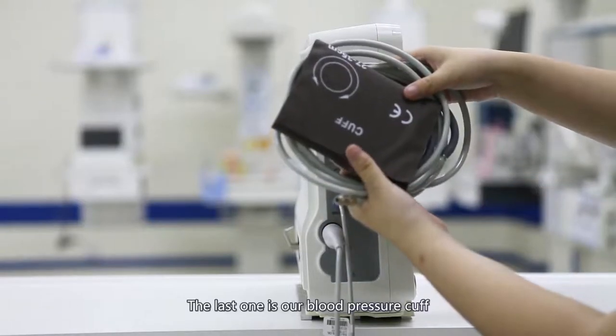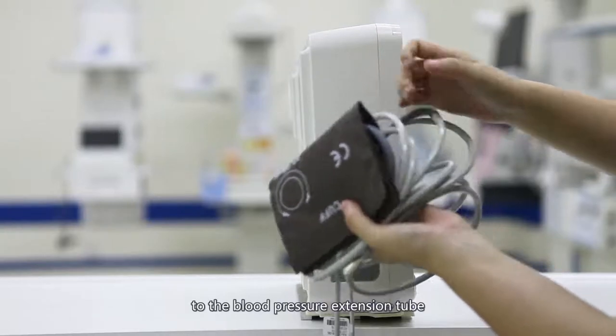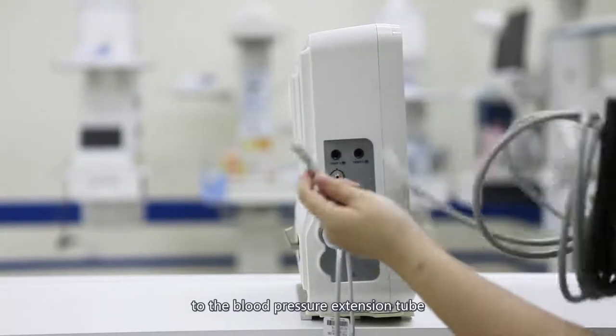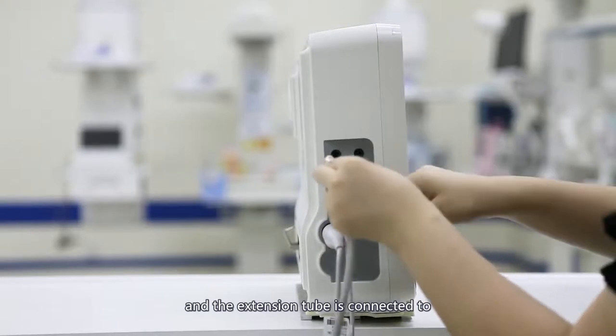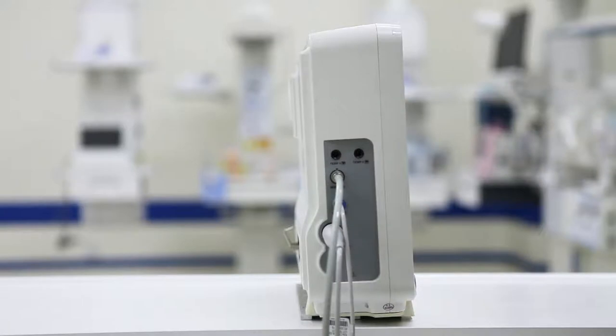The last one is our blood pressure cuff. Connect the blood pressure cuff to the blood pressure extension tube, and the extension tube is connected to the blood pressure interface of the monitor. The interface will automatically lock in place.